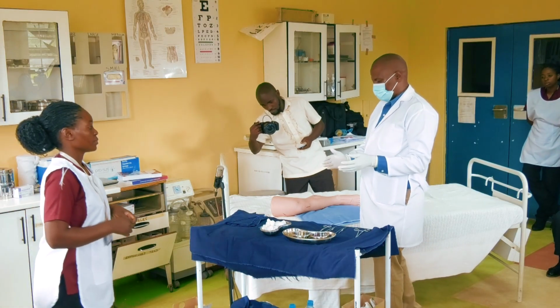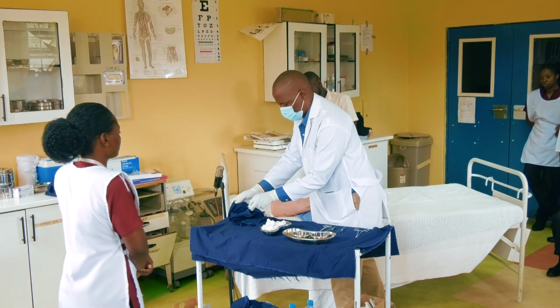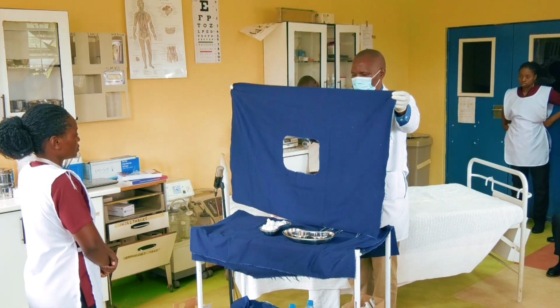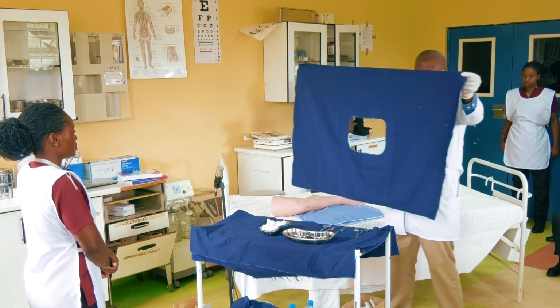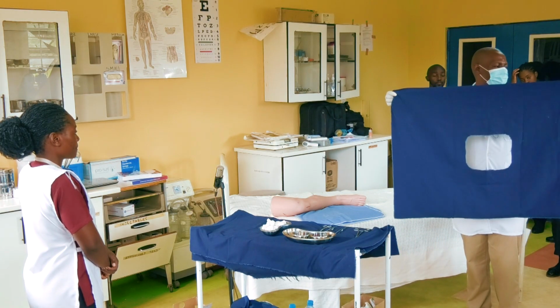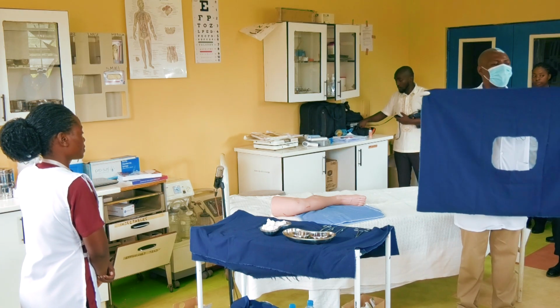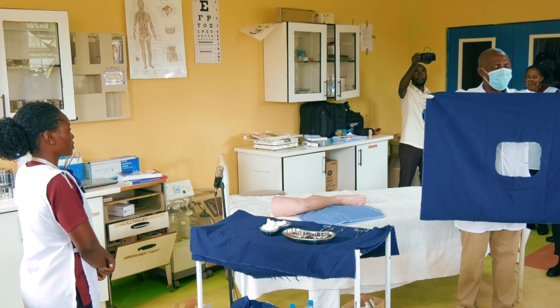So the next thing is I have to drape here, right? Remember what we did. Again, same thing. I'll unfold this from the trolley just in case something falls. Which one is more sterile, the one closer to me or the one on the other side? On the other side. Which one is supposed to be in touch with the patient? On the other side. You can do the right thing.